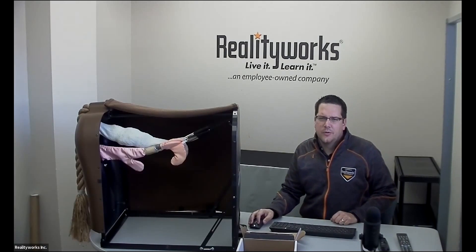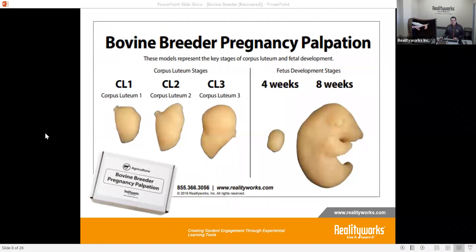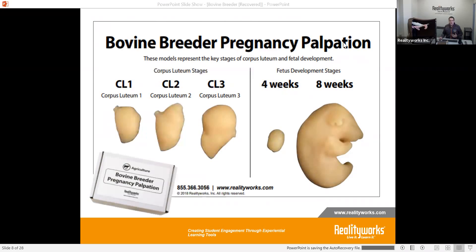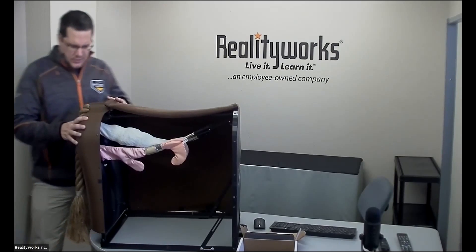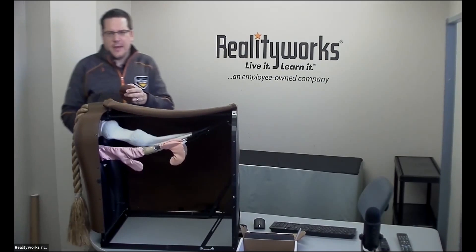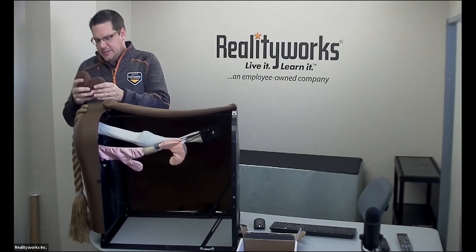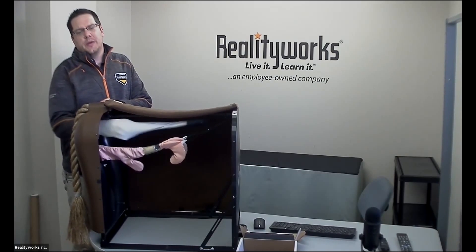Looking at the product, we've included a new part: the bovine pregnancy palpation. This product has the ability to not only focus on insemination, but also on pregnancy palpation. In the back end here, we have the ability to go inside and actually feel through. We have poop bags that provide the understanding that you have to get inside the rectum to be able to feel inside there.